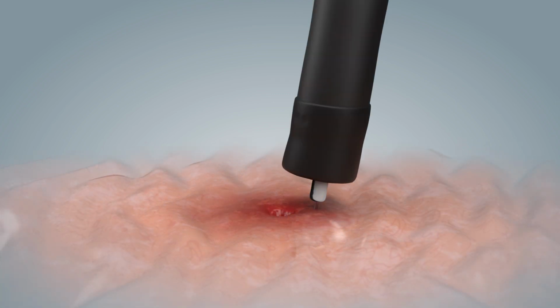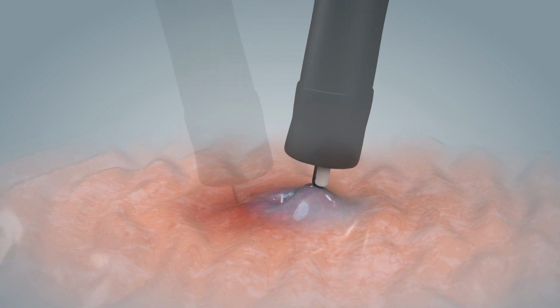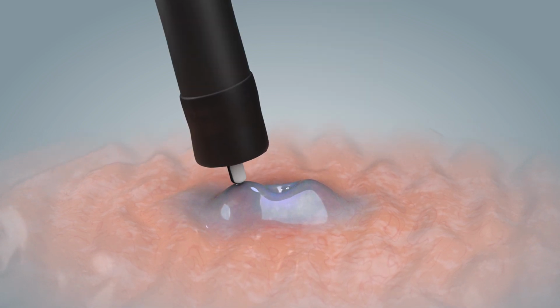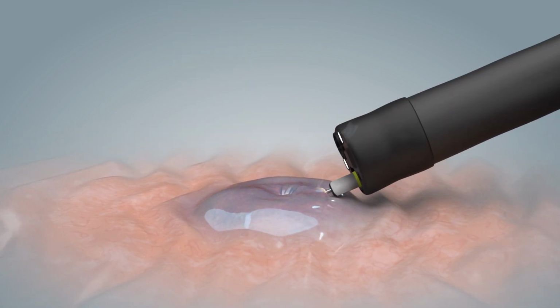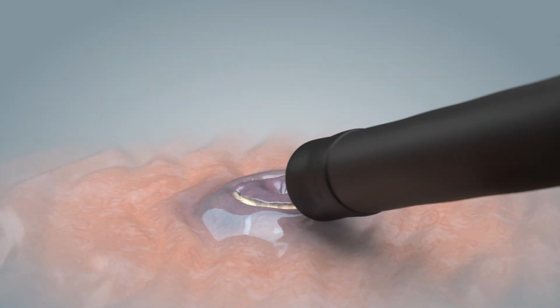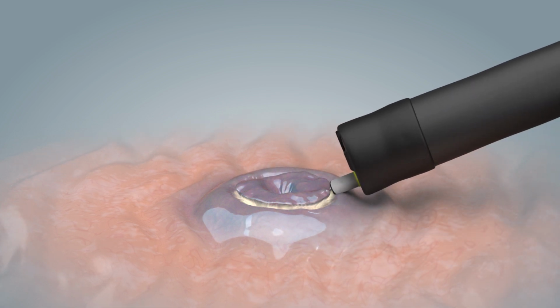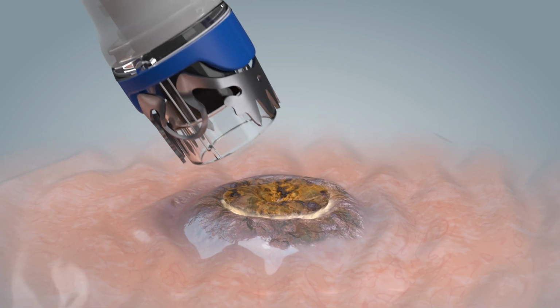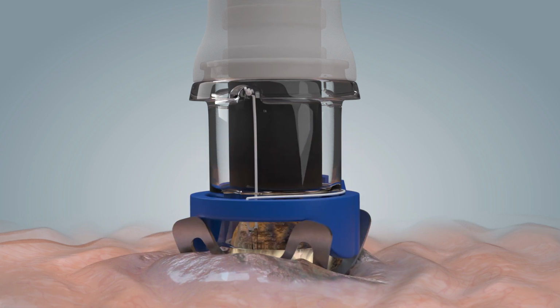The optimized fistula closure, using submucosal injection and mucosal incision, can achieve good treatment results for otherwise therapy-resistant fistulas. Preparing the tissue through a circular incision of the mucosa, for example with the aqua knife, can lead to reduced tissue tension around the fistula opening and more effective tissue compression by the clip. Here too, the tissue in the fistula tract should be freshened to promote better healing. During clip application, the clip is applied to the incision line.